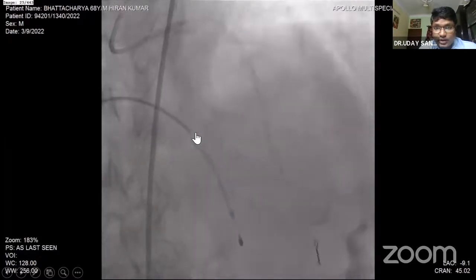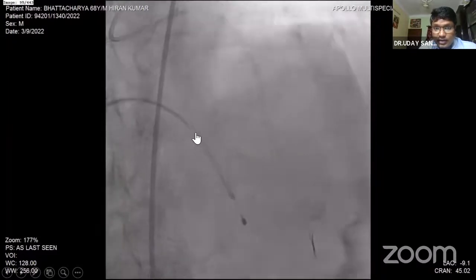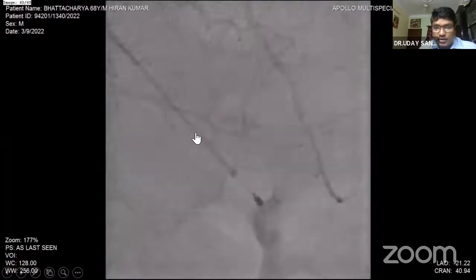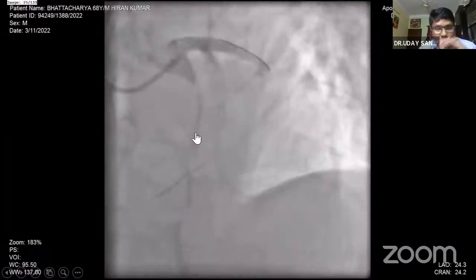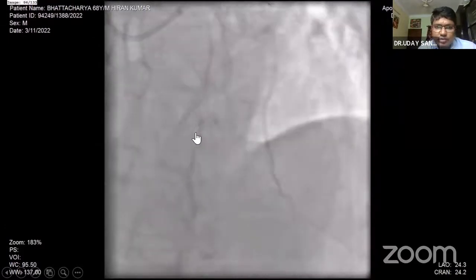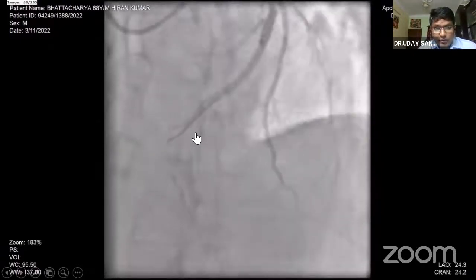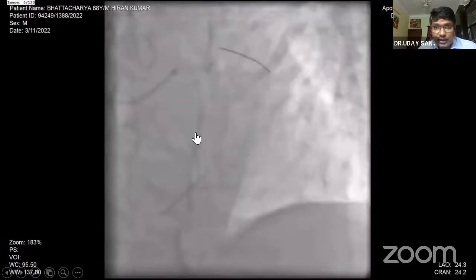So I tried with the pre-dilatation balloon. Iatrogenically it was ruptured. I had given 100 microgram initially, followed by another 50 microgram of adenosine. After this, the result was quite okay, and his hemodynamics improved quite a lot. But the problem was, one day after, his ST was not satisfactorily resolved, and he had some amount of chest discomfort. So I took this patient again to the cath lab 2 days after the primary procedure for LAD stent patency, and he was quite okay, at least angiographically.